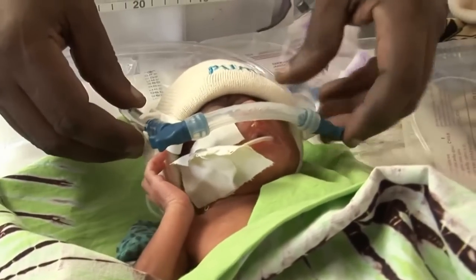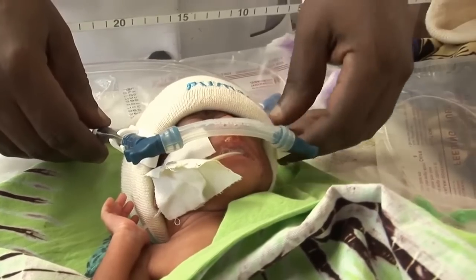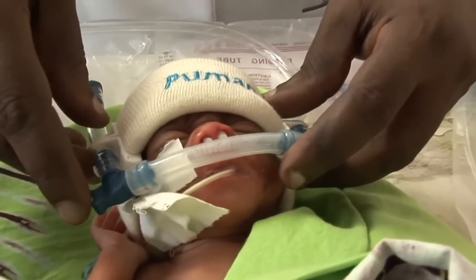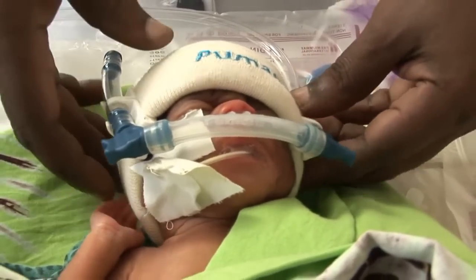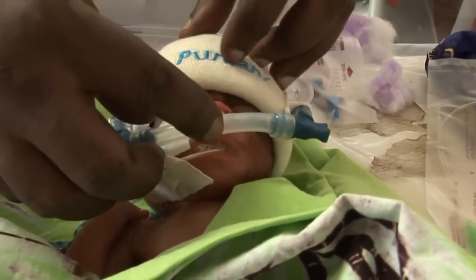You can make adjustments if you need to, so that the prongs are held in place. You need to keep a good eye on the machine to make sure the water stays bubbling, as this is the best way to tell if the baby is receiving air and oxygen. If it is not bubbling, make sure the prongs completely fill the baby's nostrils. If it is still not bubbling, check for a kink in the tube or a bad connection.